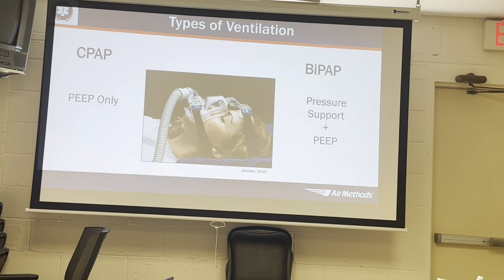CPAP provides just PEEP. That's all I have to say about that. It's a continuous pressure. Most people don't complain too much when you put them on CPAP. They're pretty chill a lot of times. Probably giving them a PEEP of 5, maybe a PEEP of 10. But we're just providing some extra support to keep those alveoli open.